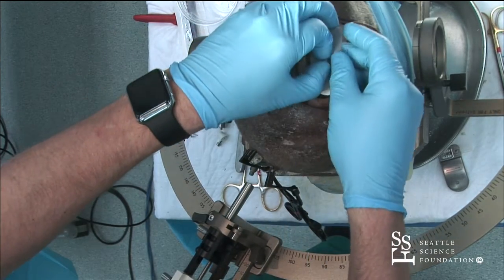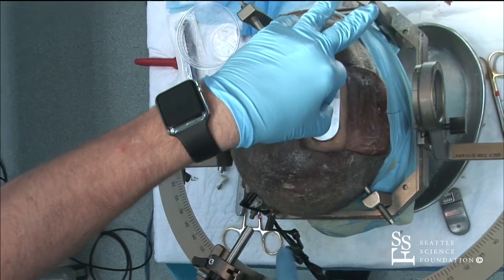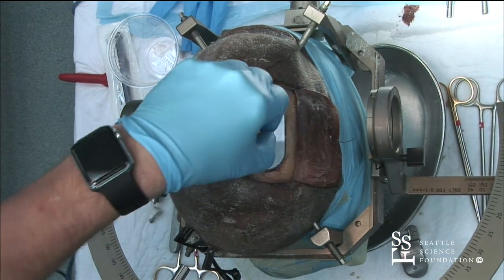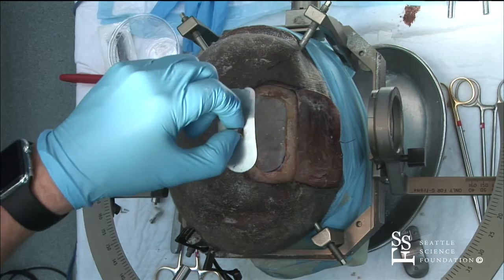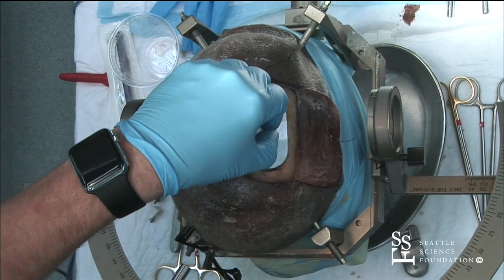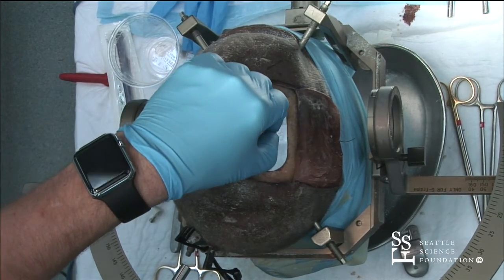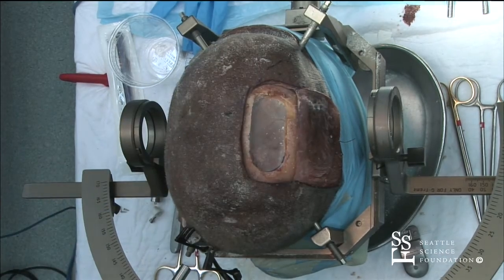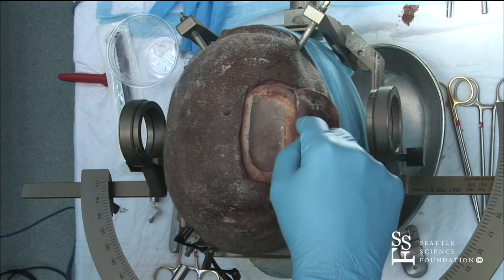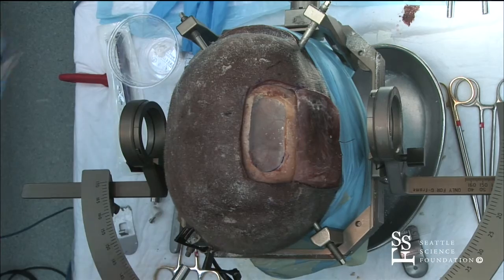So again, I'll put that on the skin, then I'll mark a U incision right around that, which we've already done here, open it up, and then you can place this right in the bone. The hardest part of the case is actually trying to draw around the template with a pen without moving it the entire way around. And Daniel, our fellow here, has already done that beautifully. So then basically I make a burr hole and then a side cutter to cut out the craniectomy.